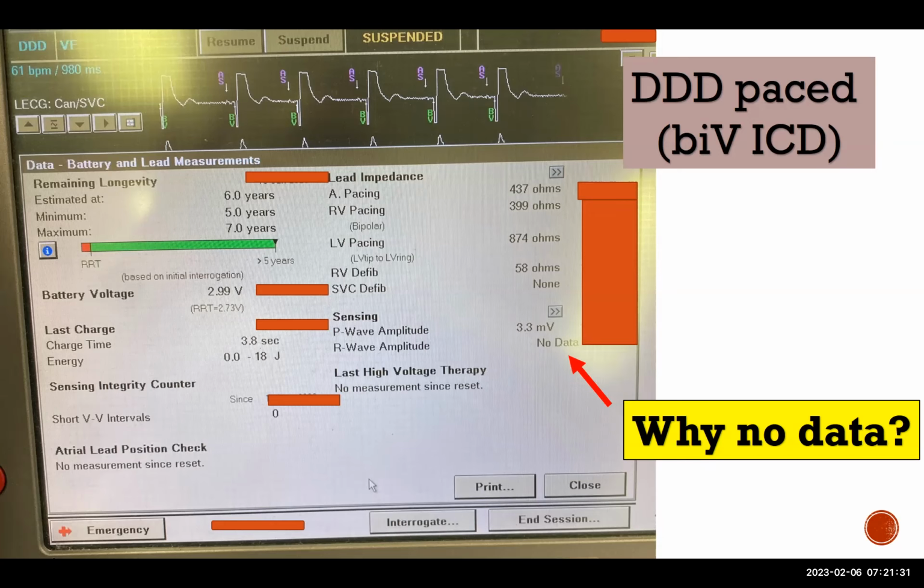And so the theoretical benefit of a lead that has both of those coils is that on average, it's expected that the defibrillation threshold, or the amount of energy required to defibrillate someone, would be lower if you have more shocking vectors. Turns out that the difference is very negligible in most patients, and SVC coils can become very heavily scarred, meaning that when it's time to remove a lead or extract it, the presence of a second coil makes the extraction much more dangerous.